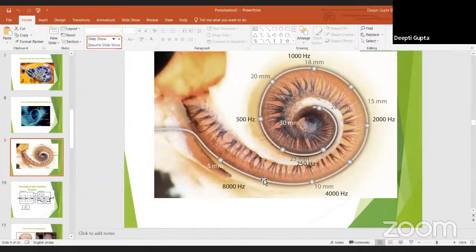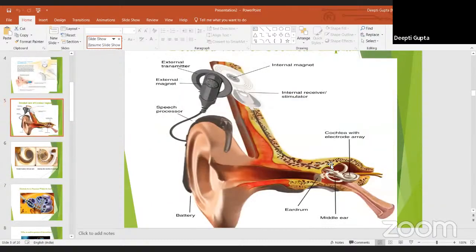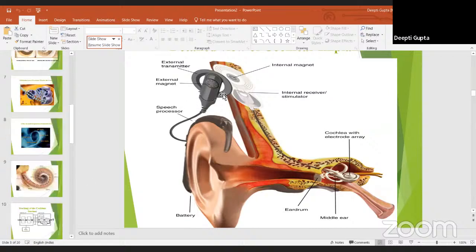You can see from here that up to 8000 or 9000 is the range in which we are working for our electrodes. What is this? I'll explain a little later. So now I think it is clear how it is working. Now I'm going into more detail about how these things work internally.